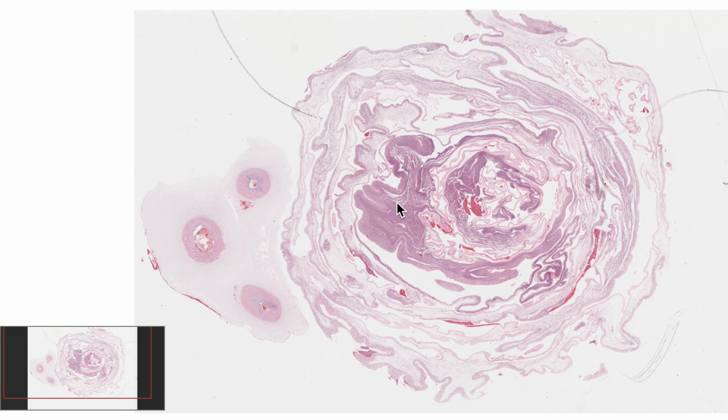And just for our orientation's sake, right here you see this simple cuboidal lining. So this layer is your amnion layer, the layer that faces the baby. And then here is the chorion layer, that roughened area that we just saw.